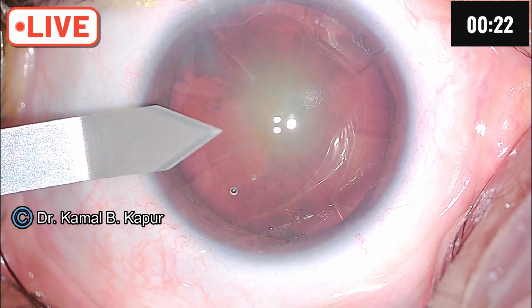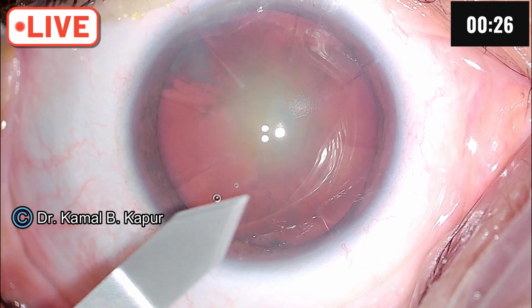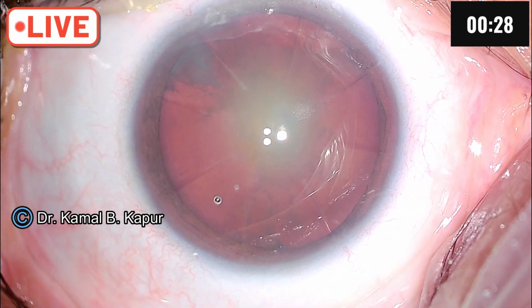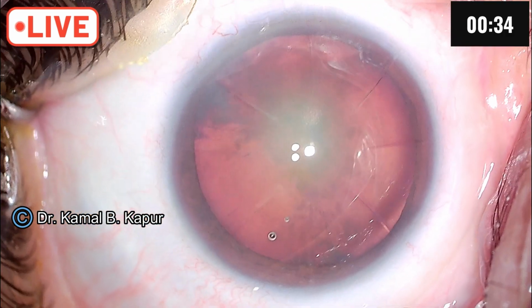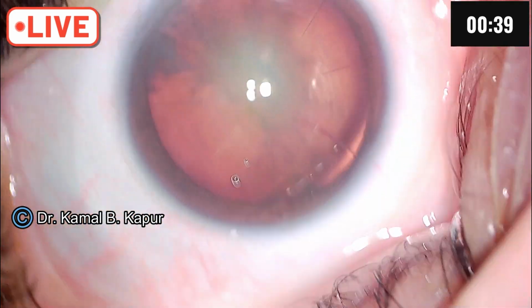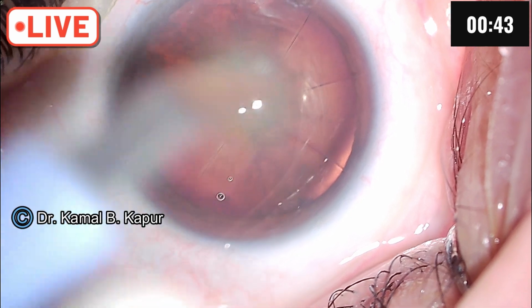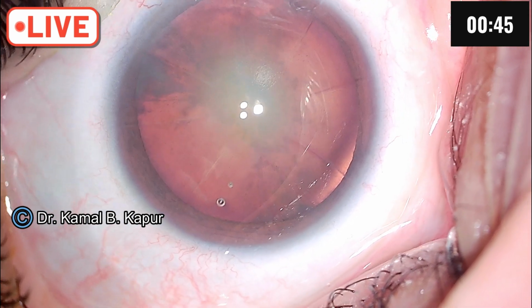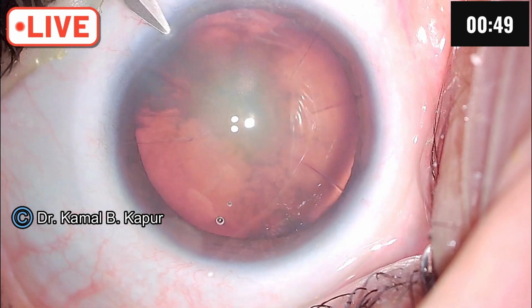You should have at least 0.75 to 1 millimeter on either side of your keratome. So, I will rotate my microscope to have the widest area of entry. You can notice that I am aligning my position according to the port. So, this area for me to enter. Always have a little limbal entry in these cases.